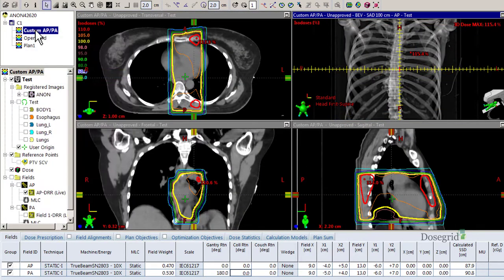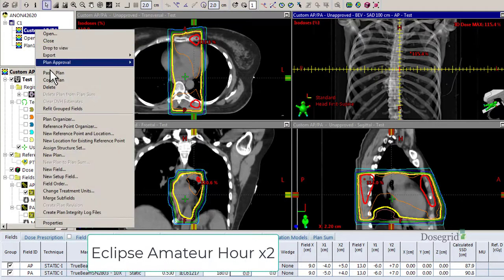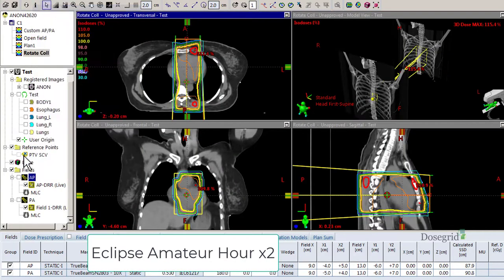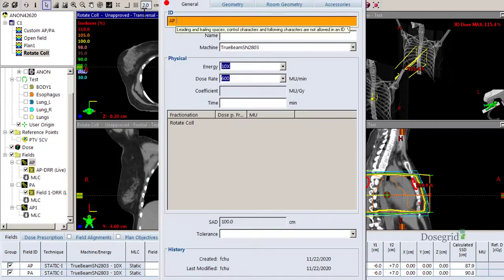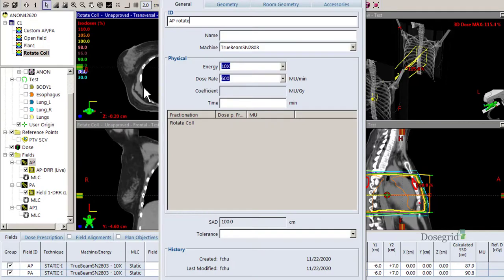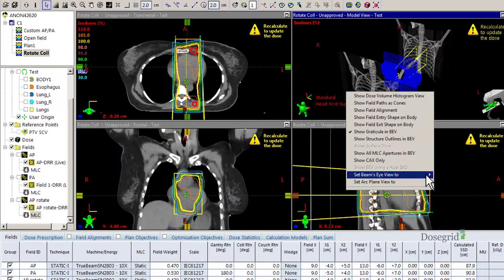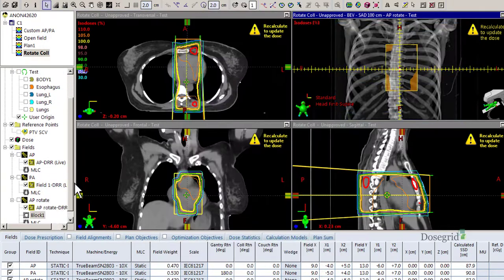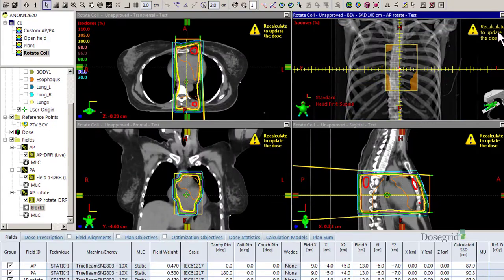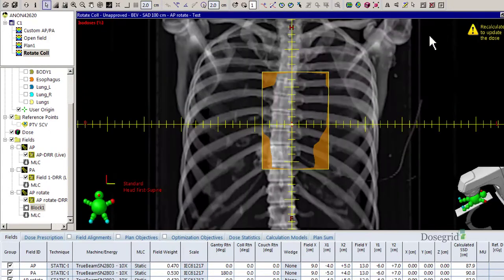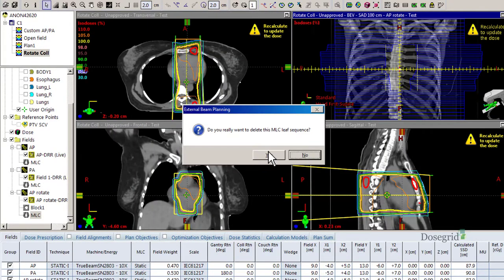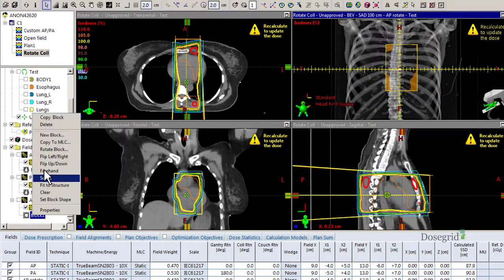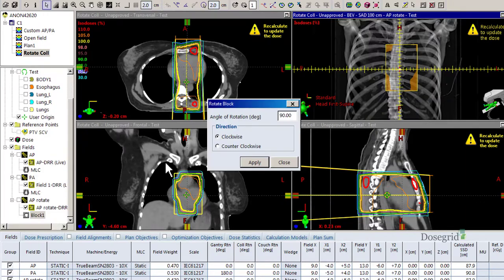First, copy and paste a new plan just in case you mess up. Copy your field. Copy your MLCs to a block. Delete your MLCs, then rotate your block 90 degrees clockwise.